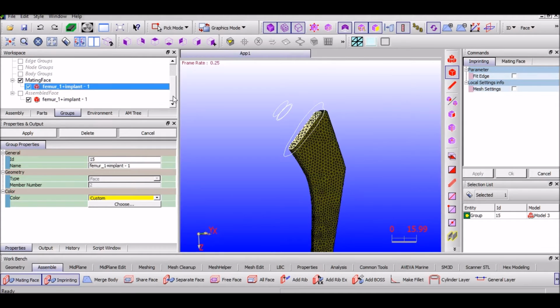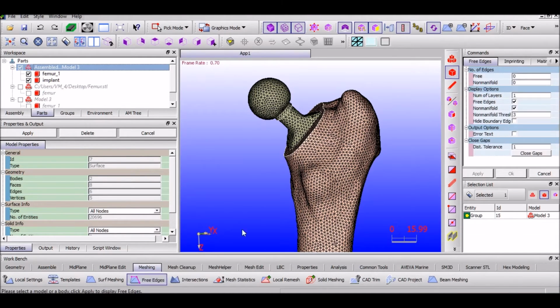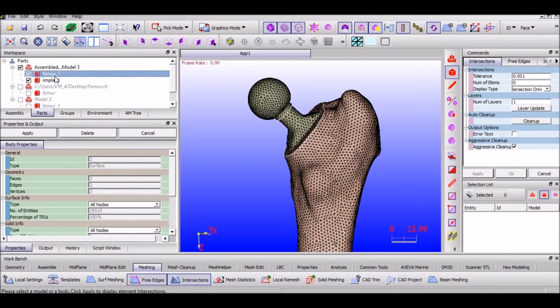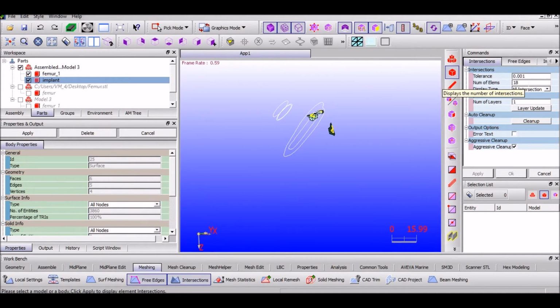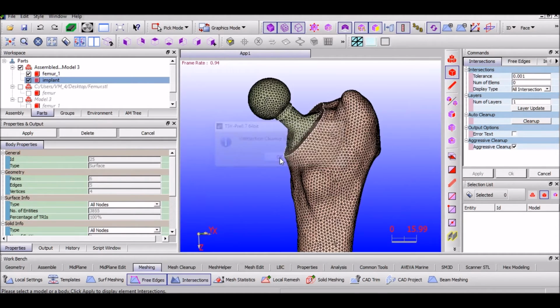Under Parts, as you can see, a new assembled model has been generated. This model needs to be cleaned. Therefore, it's checked for free edges and intersections, much like the previous tutorial. Since intersections are present, cleanup is applied. Intersection cleanup has been completed successfully. Thus now the model is ready.